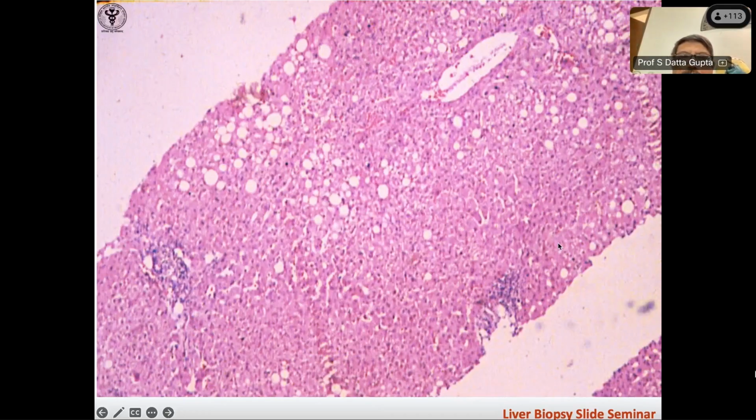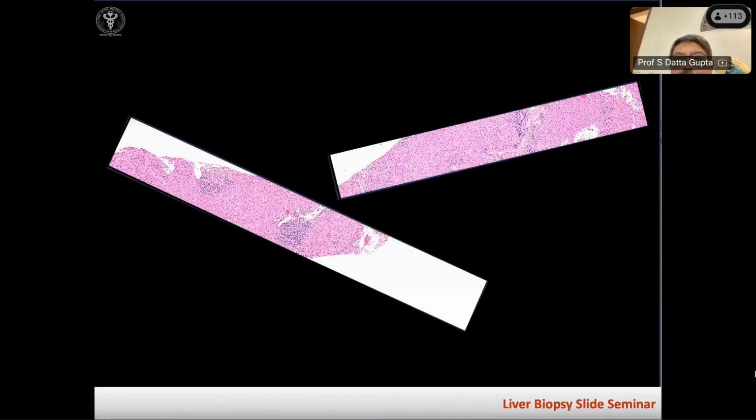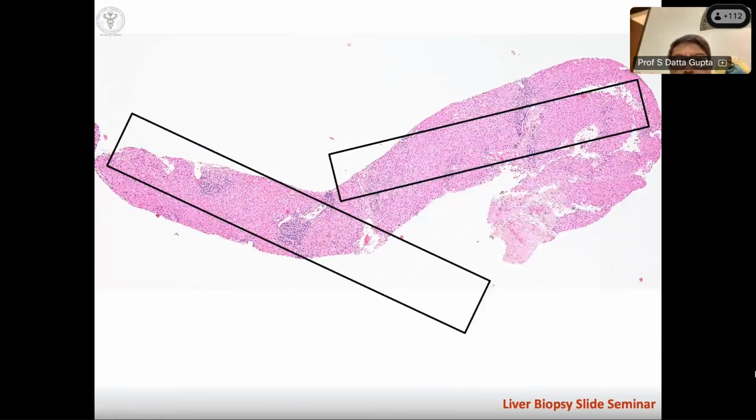So that is difficult. For example, in this liver biopsy, the needle is like this, and the inflammation looks a lot more than what is here. And I think that's obvious even to a first year resident. But actually, this is the same core.